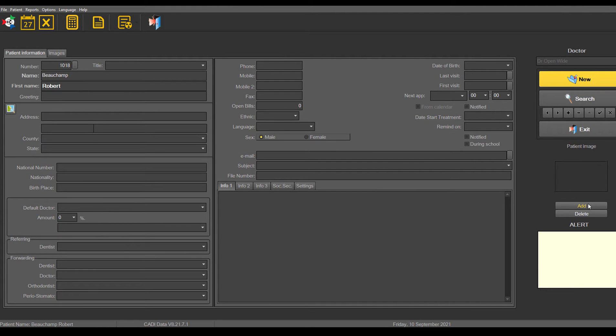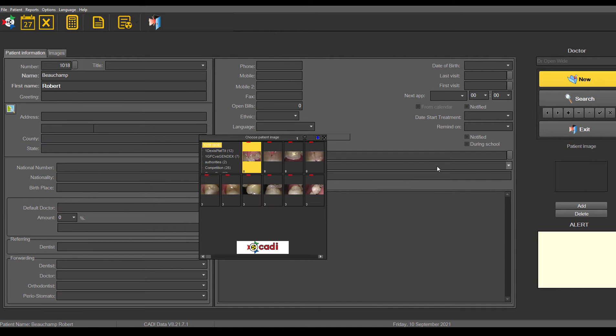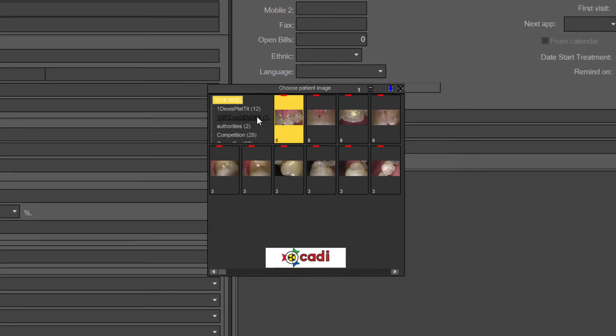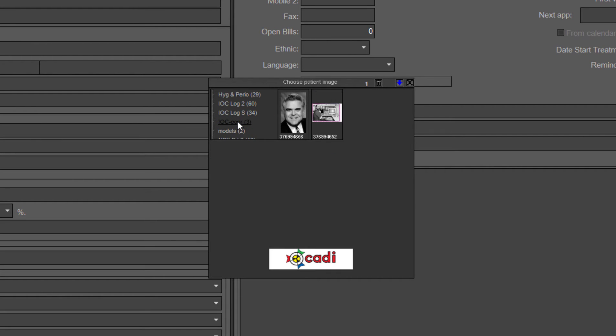Then when you come in here, you just click on add to add the picture. And then you'll just go down and find out where that picture is.